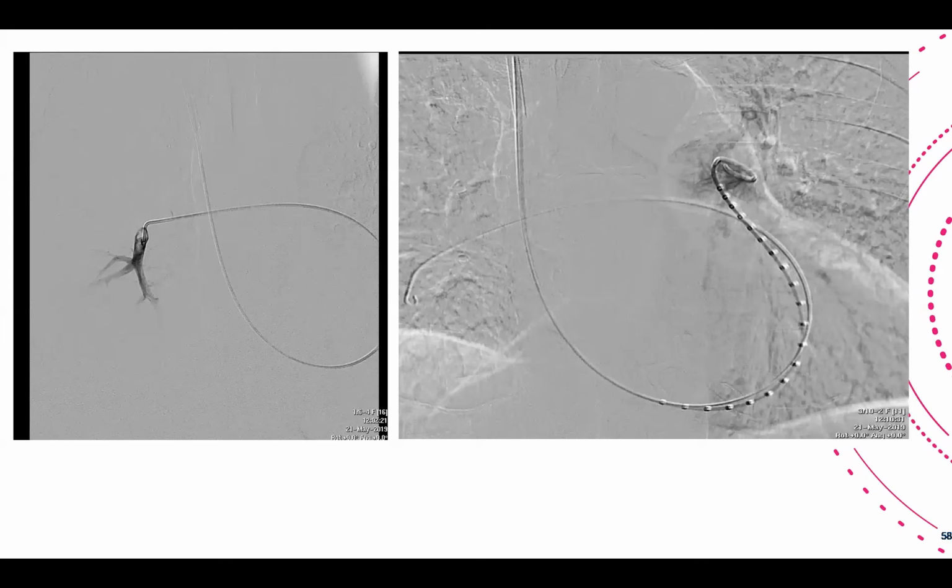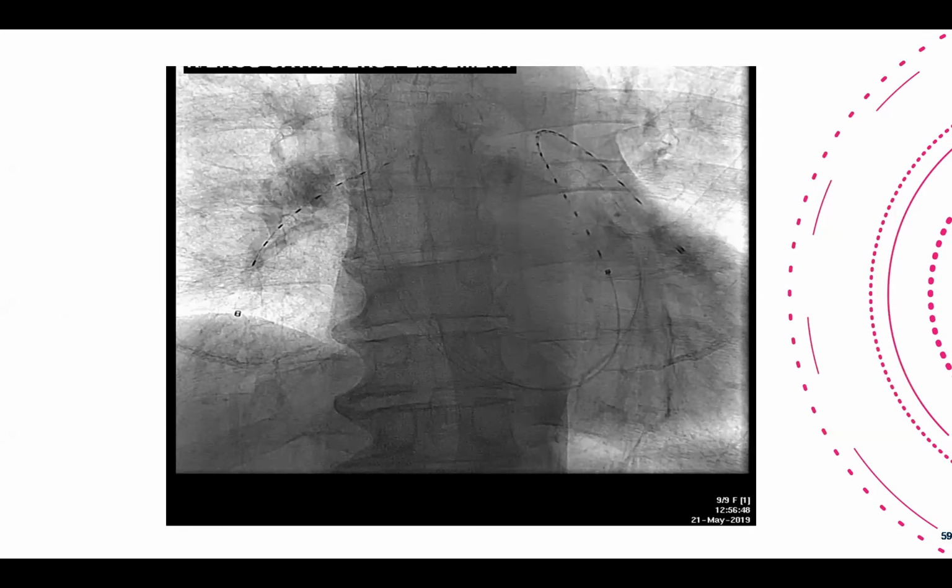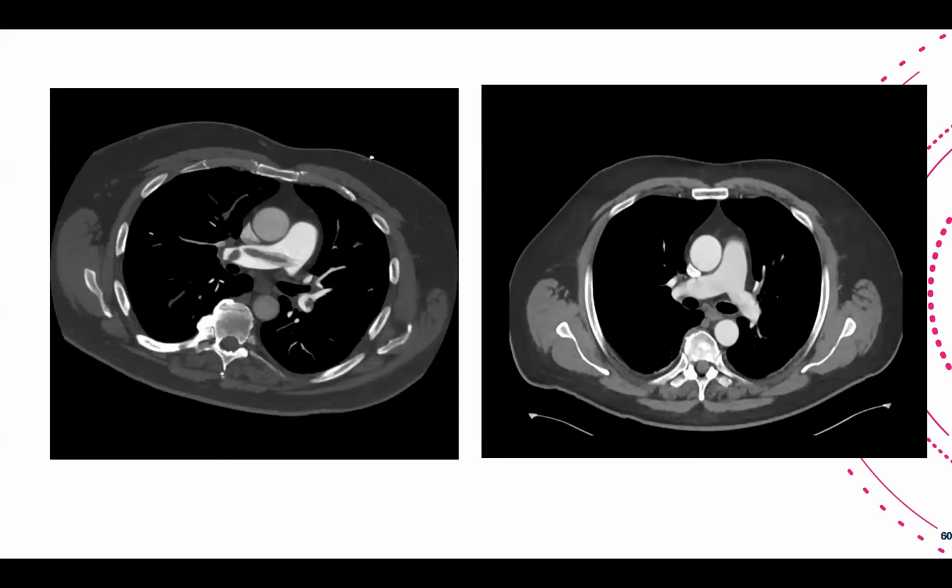So this is an angiogram. See how far we can put our catheter. This is the right side circulation, subsegmental circulation. This is the left side. And we leave catheters there on the right and the left. So these are the dots for the ultrasound generation. And at the same time, we infuse alteplase. And this is the result that we got.